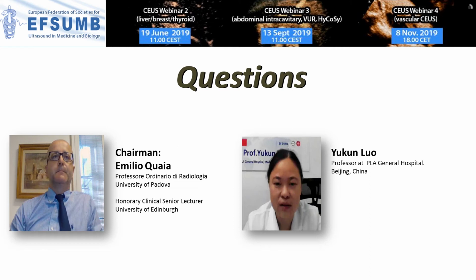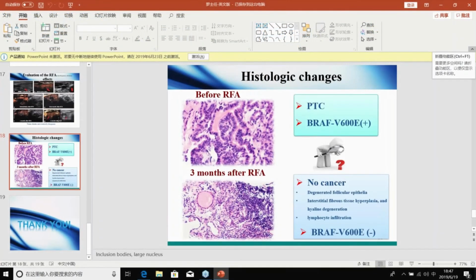Yes. Here I will show your slide. CEUS can assess whether the tumor is active or necrosis. So after ablation it can be evaluated by CEUS. Yes.